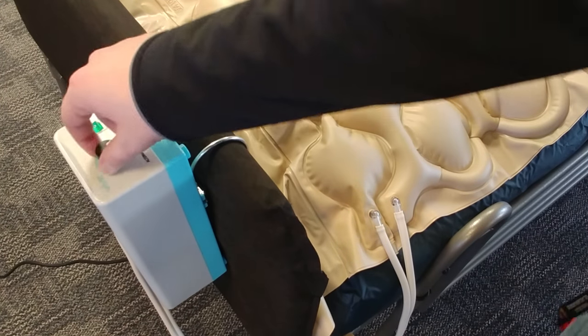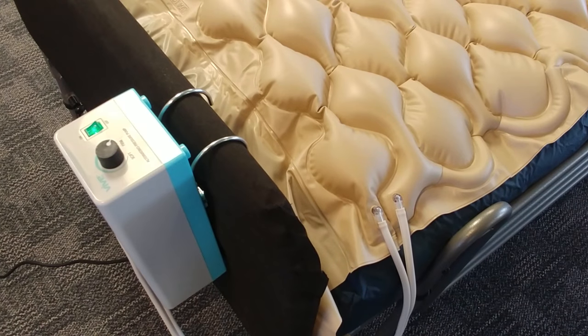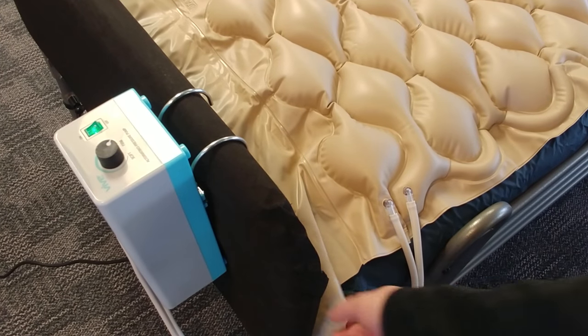Right now I have it set all the way to firm. It's been inflating for a few minutes. Generally at the firmest setting, to go from empty to fully inflated and ready to start alternating takes about 15 to 20 minutes. That's what I've got here.